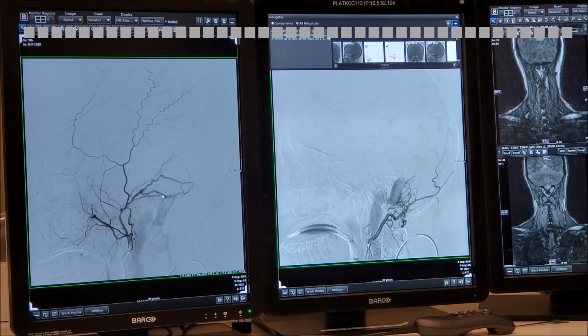So the occipital, and if I put my middle meningeal here, I'm starting, here is the superior part, the anterior superior part of the supply to the dural fistula, and here you have this network, which is in another part of the wall of the sinus. So we're starting to reconstruct what we saw in the MR. Still missing something.